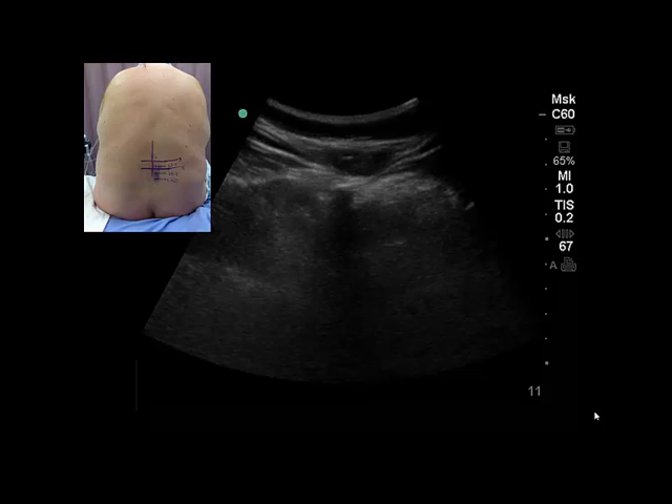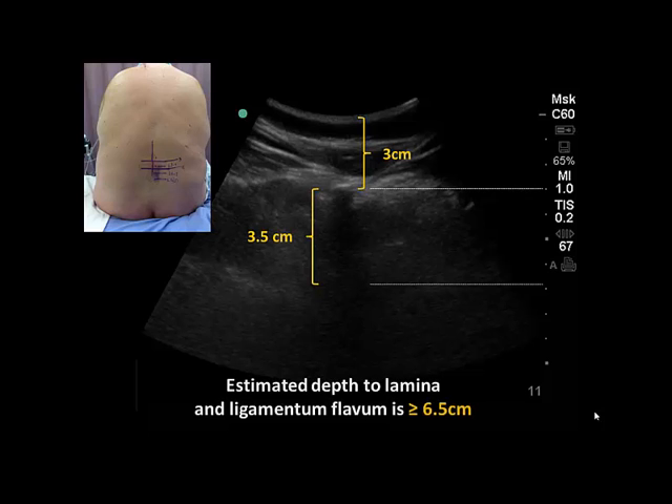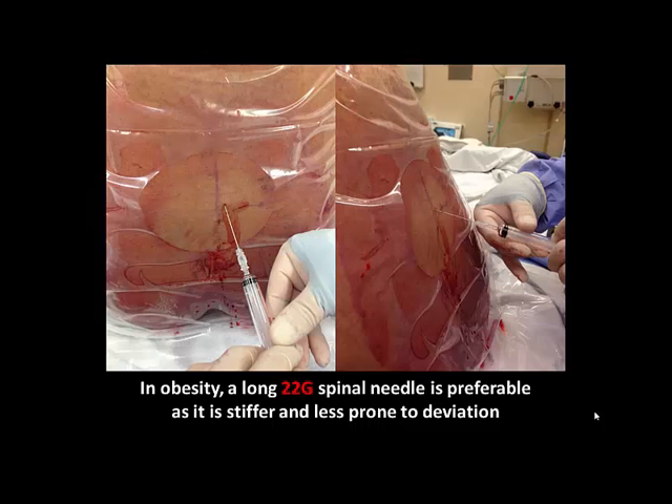Note that in obese patients, a longer needle may sometimes be required, and the need for this can be determined by measuring the depth to the tip of the spinous process. The anterior-posterior length of the adult lumbar spinous process is approximately 3.5 cm, and thus the minimum depth to the lamina and the ligamentum flavum can be estimated by adding these two distances. If a longer spinal needle is used in obese patients, a 22-gauge needle is preferable to a 25-gauge needle, as it is stiffer and less likely to deviate from its intended trajectory.